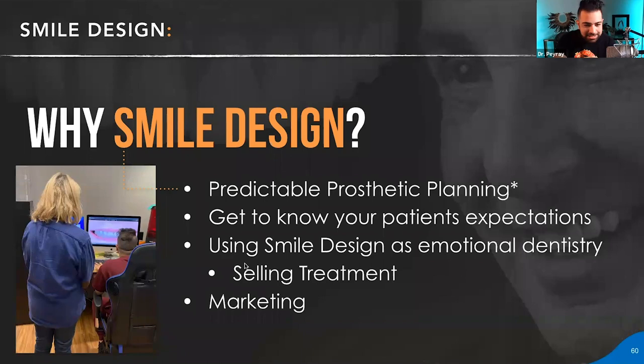This is a photo, I think last week we took. You can see the patient is showing, and I'm looking at my smile design computer and I'm sharing with her, because here's me asking her, okay, what kind of teeth do you see? And then I'll show her face. Do you like this? Do you like that? Patients always give you some feedback that you want to hear. Where did they come from? What are they looking at? Because it makes your life easier.